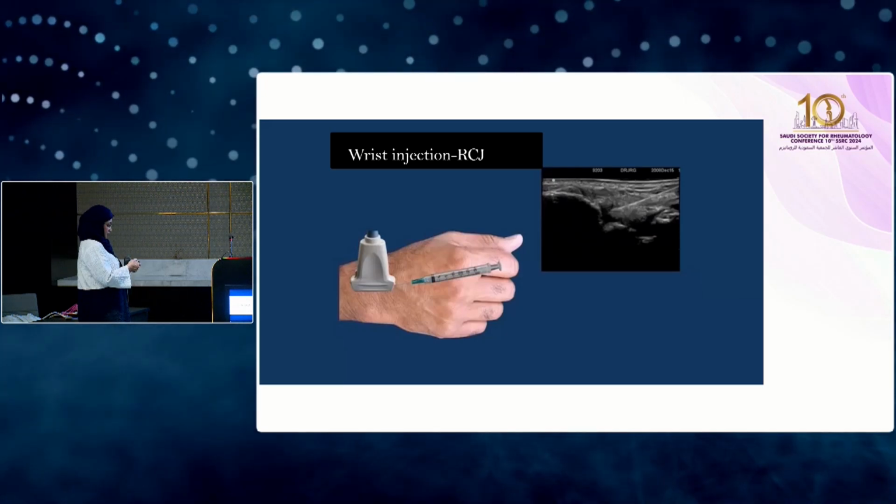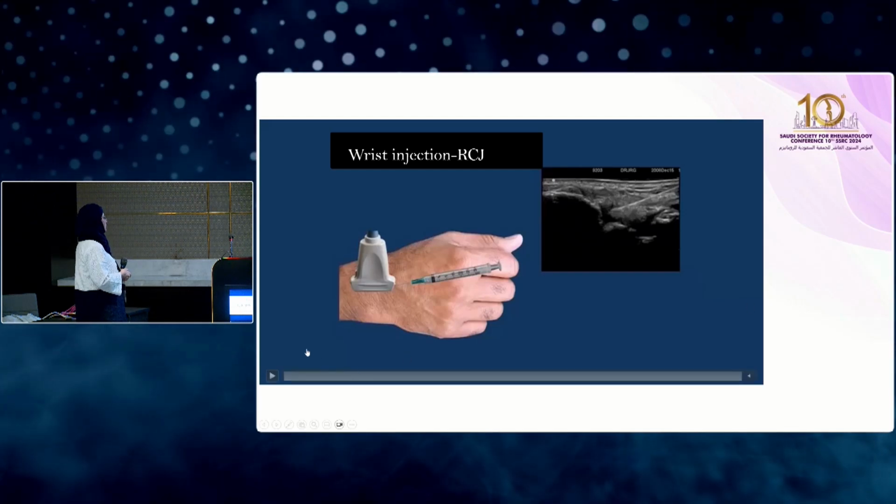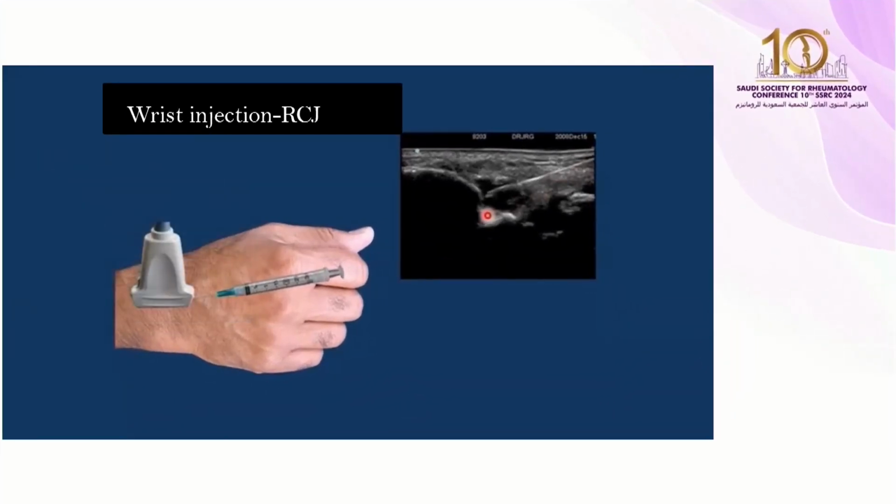Can I have the video, please? And you can see that the needle is coming from distal to proximal, and you will inject safely and properly to the target.